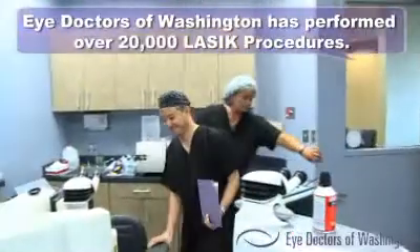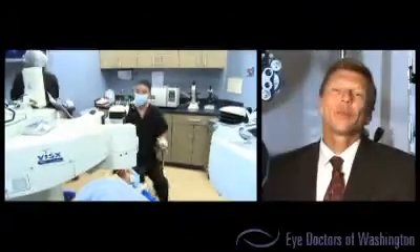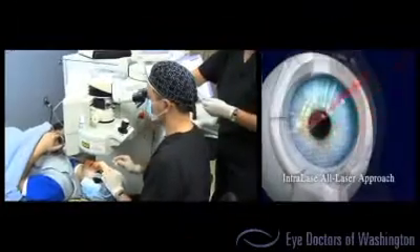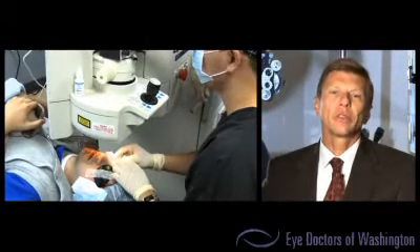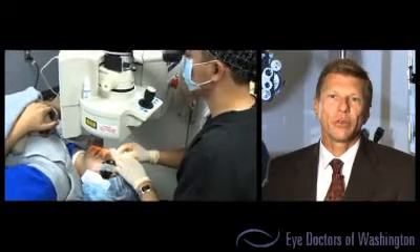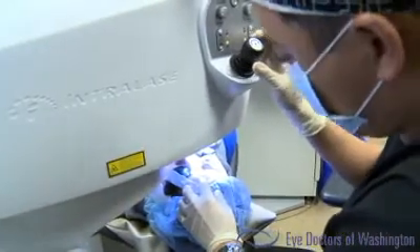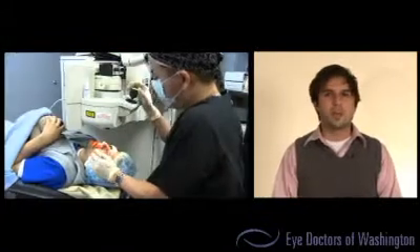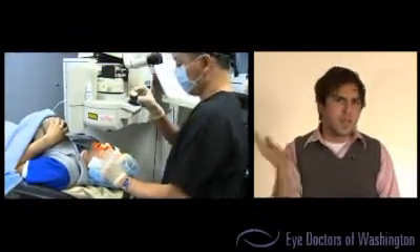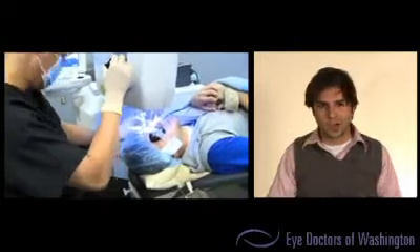Hey Danny, you ready? Dr. King, I'm here. All right, we're just going to get you started here, okay? During the first part of the procedure, we create the LASIK flap using the intralase. The intralase creates tiny bubbles in the cornea to create the flap. We place a docking station or an interface onto the surface of the eye. During this process, you will feel some pressure, and your vision will actually go dark. All right, Sammy, I'm just going to turn your head just a little bit this way. Good. Just relax — you're going to feel a little bit of pressure here. You know what? They were honest. There was literally, like they said, a little bit of pressure. It wasn't like it hurt at all. I never could feel any pain.